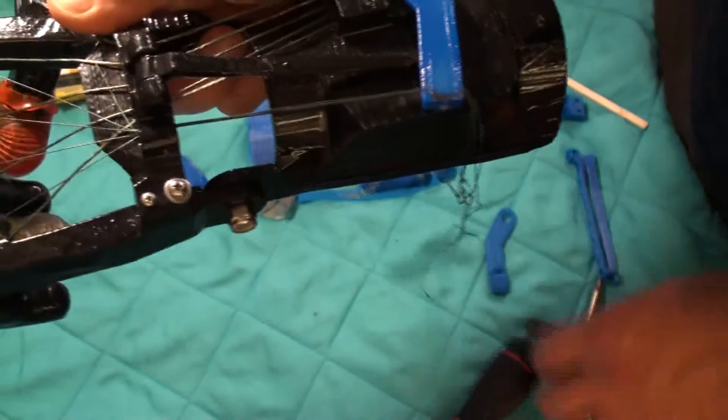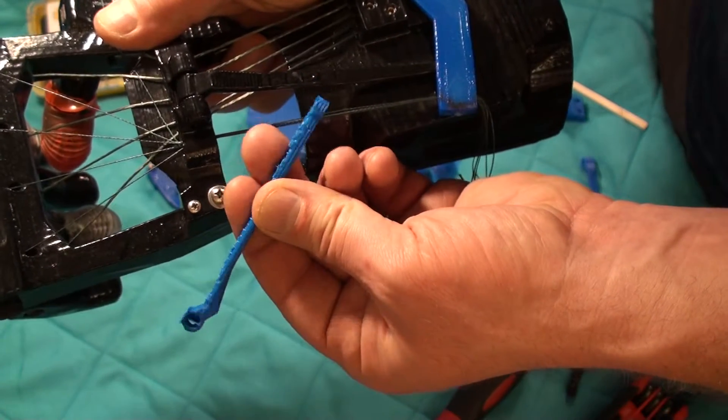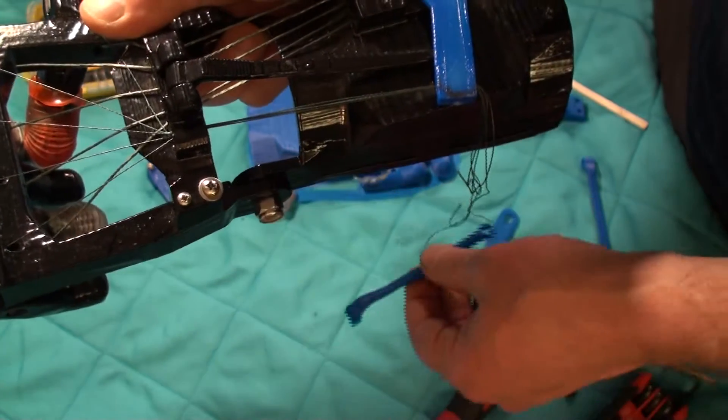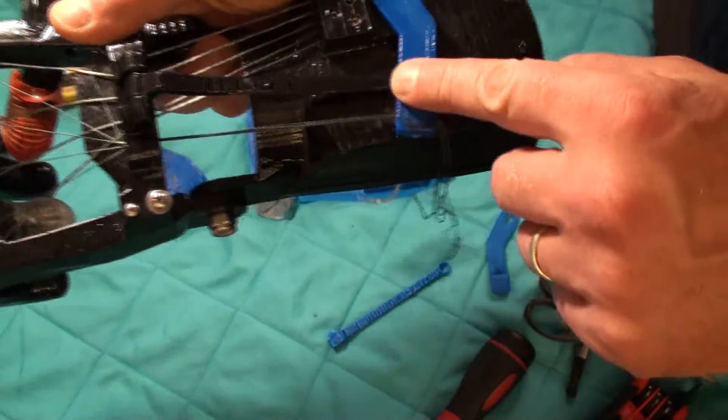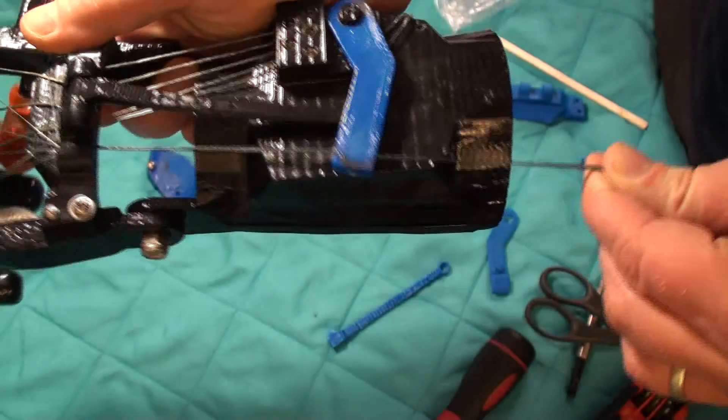There's this bar here, and it pushes on the pivot, and the pivot runs the extensors.